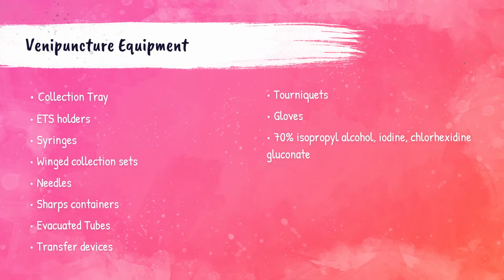The evacuated tube system is the most commonly used means of collecting specimens. It consists of a plastic holder, the evacuated sample tube, and a double-pointed needle. One end of the double-pointed needle enters the vein, and the other end pierces the top of the tube. Once the vein is punctured, the vacuum inside the tube aspirates the blood. The evacuated tube system reduces the risk of direct exposure to the patient's blood and has made it easier for phlebotomists to take multiple samples from a single venipuncture stick.